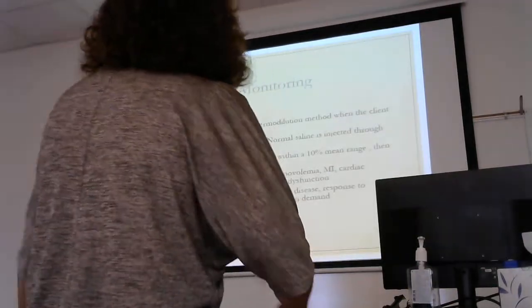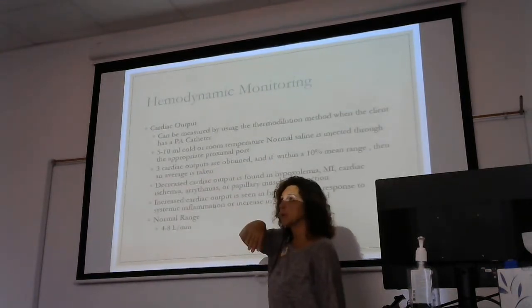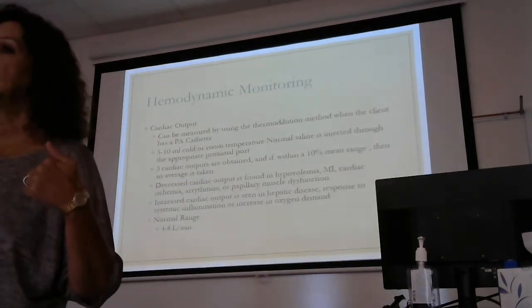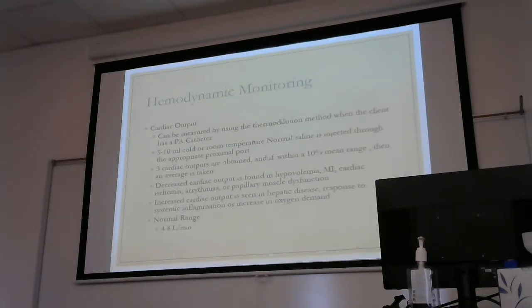Don't worry about this one. I don't even know why we have this on here, to be honest with you, you will definitely not be tested on it. We don't do it like this anymore, but the state says it has to be there, so there it is. Those were my day, when we did manual injectates. We had to draw up 10 cc's of sterile iced fluid.